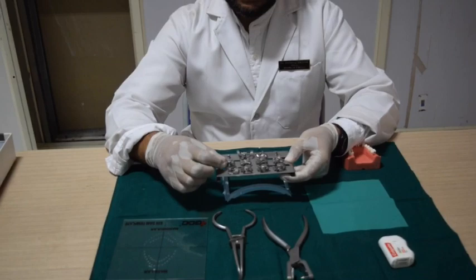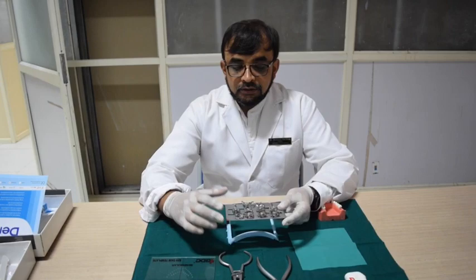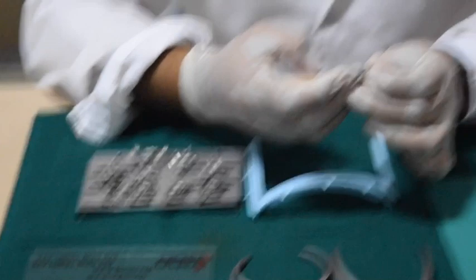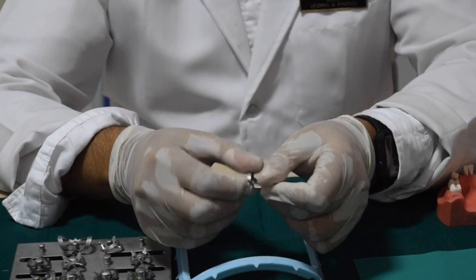There is something called rubber dam clamps. Each clamp is designed for a different purpose. Clamps are available in wing as well as wingless varieties. All these shown here are wing clamps — this part of the clamp is called the wing. The parts of the rubber dam clamp are: you have a bow, you have the beaks. These four pointed edges are called the beaks of the clamp, this is the bow, and these are the holes for encircling the floss.